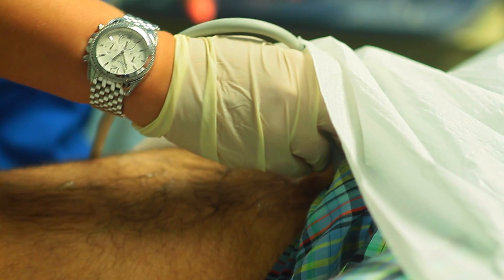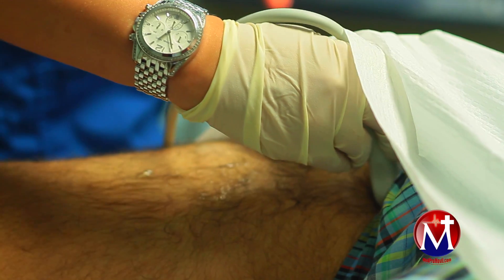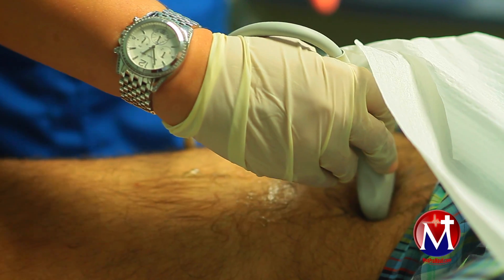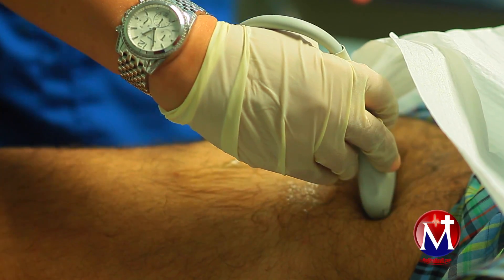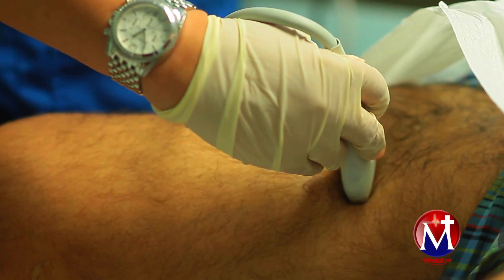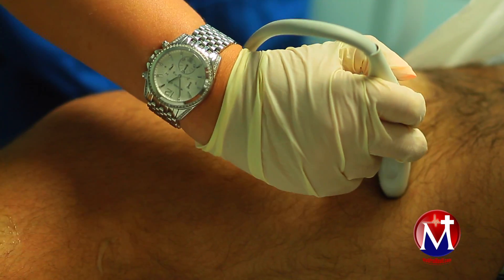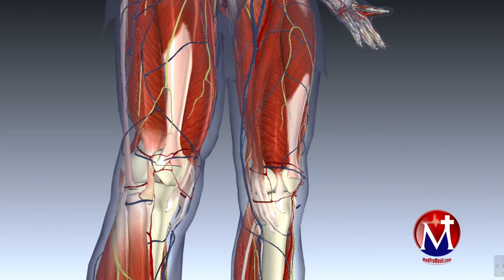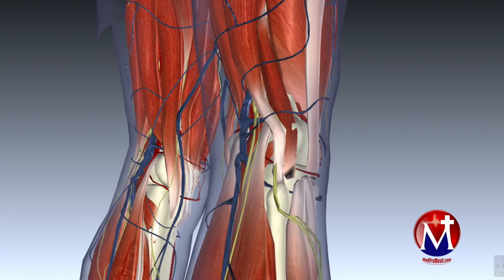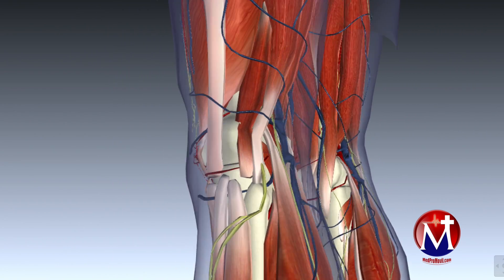Layla is now performing a duplex arterial lower extremity exam in this male patient. Duplex ultrasonography of upper and lower extremity arteries is performed to provide an overview of the location, extent, and severity of vascular diseases.